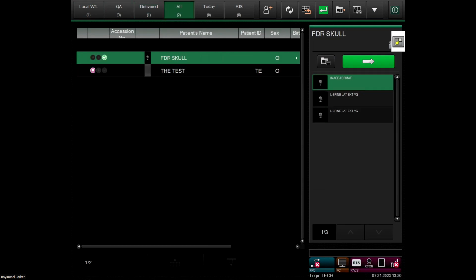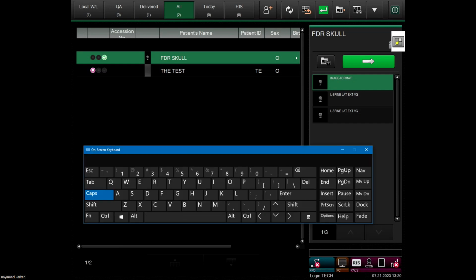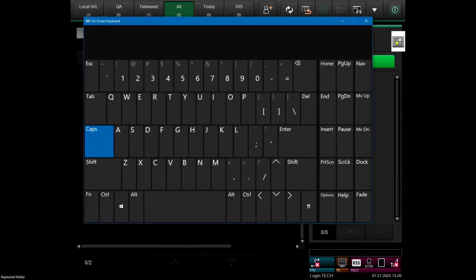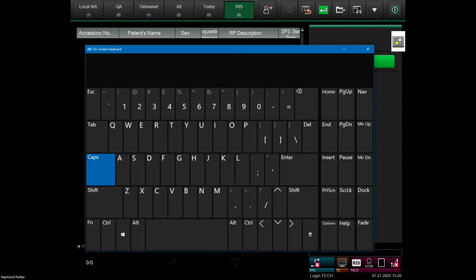I did want to take a moment on our portable here. If you look at our main display here, we do have a soft keyboard. That keyboard is available by tapping the icon to activate the keyboard. The keyboard can be moved, and then if you adjust the size, you can actually make it quite large. That's a little extreme, but just to show you how big you could get the keyboard.